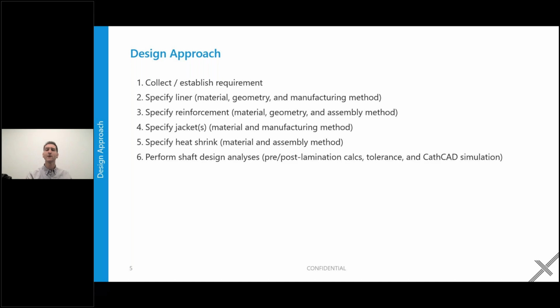There's ways of getting theoretical data. There's some systems out there for doing that that'll simulate what the outputs of your construction are. But realistically, those all have, like anything in physics and math, variables that are hard to account for, and so they're not always a perfect system. So realistically, testing parts at the end, going through 3-point bend tests and axial rigidity tests and those kinds of things are going to be your best way to really evaluate the performance of the device.